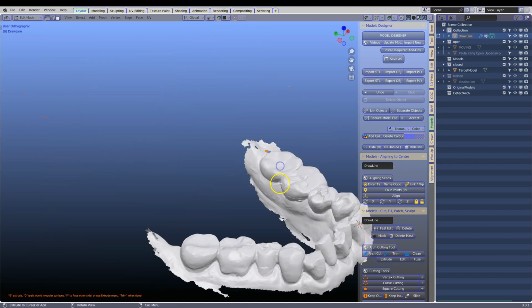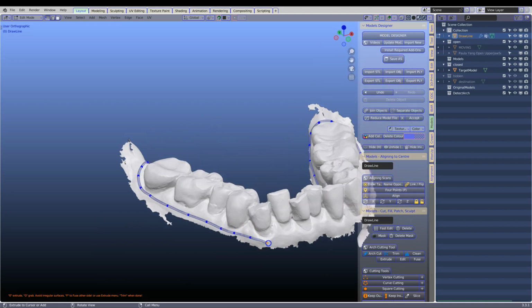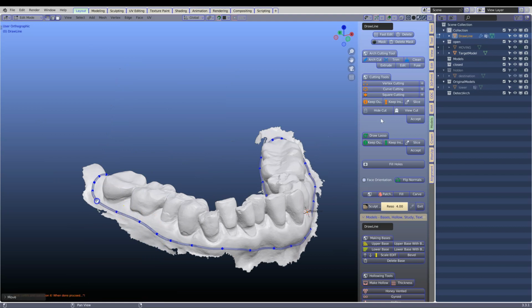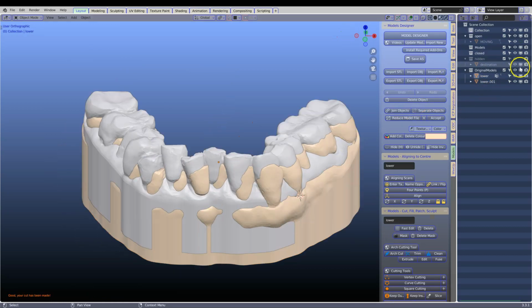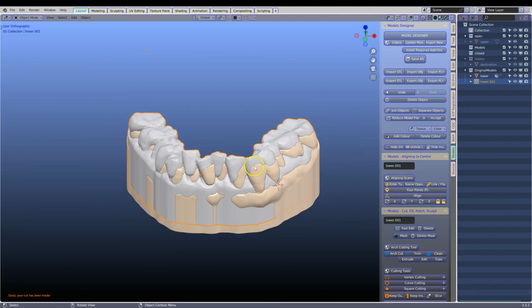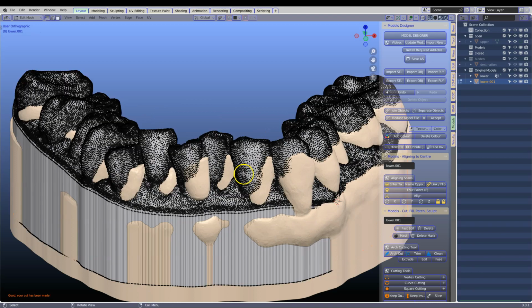Now it's time to make a model for both lower models. Then I'm going to color one model to make it less confusing. We're going to name the upper model upper. Then note how the mesh looks. It's not ideal for sculpting.